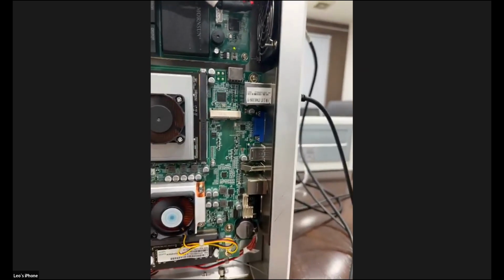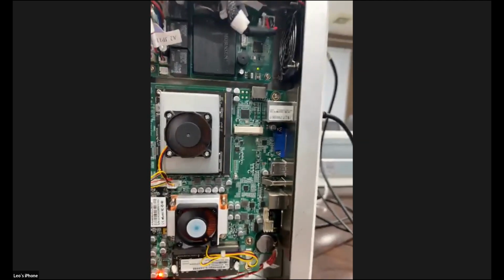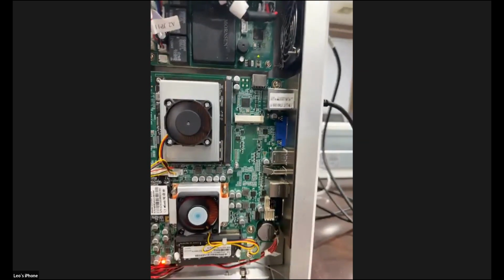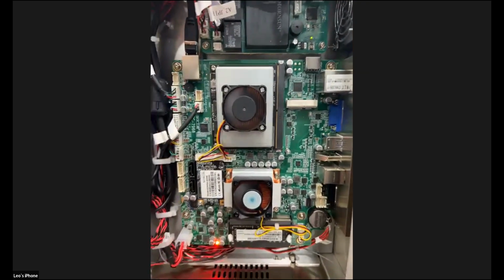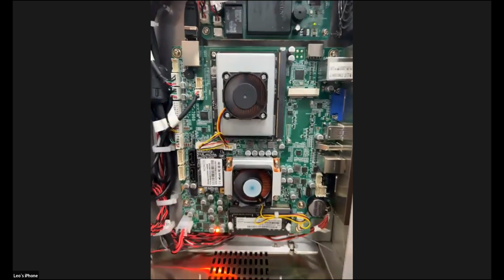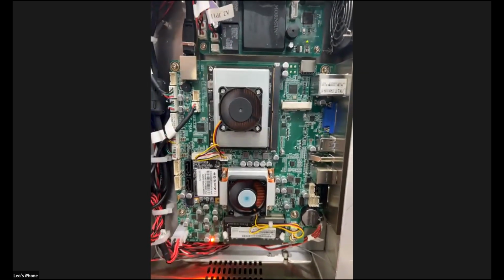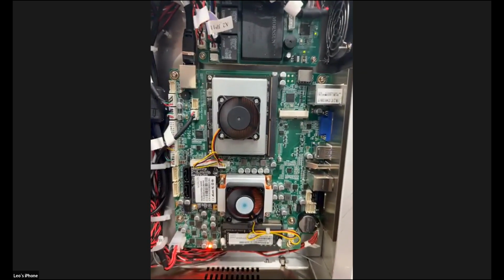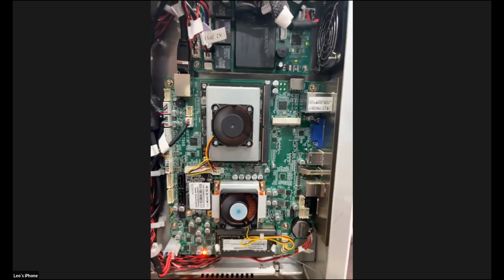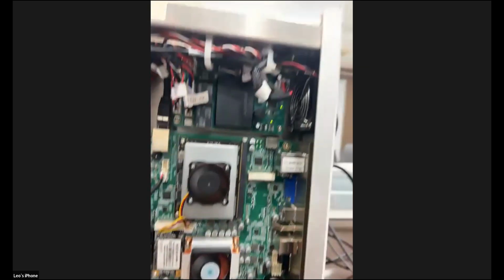All of that is included here, and this is like a main board of the machine. The function of this board is to receive the signal and the pictures from the microscope, and then analyze the pictures, and then give the results. So this is also a very important board.